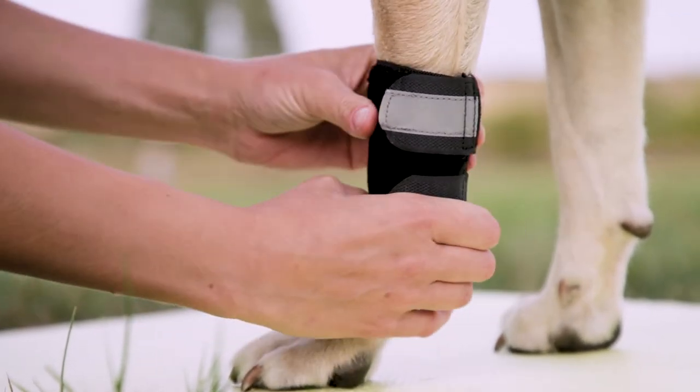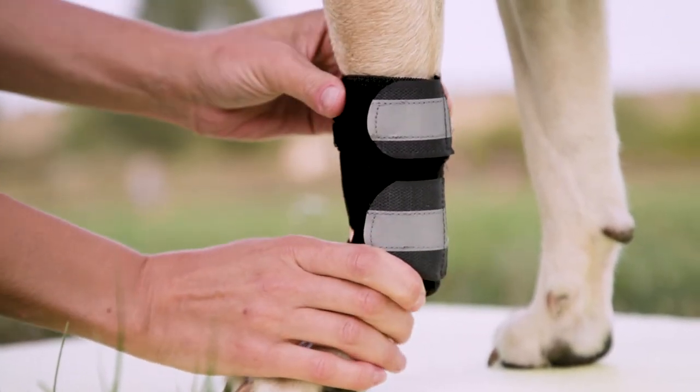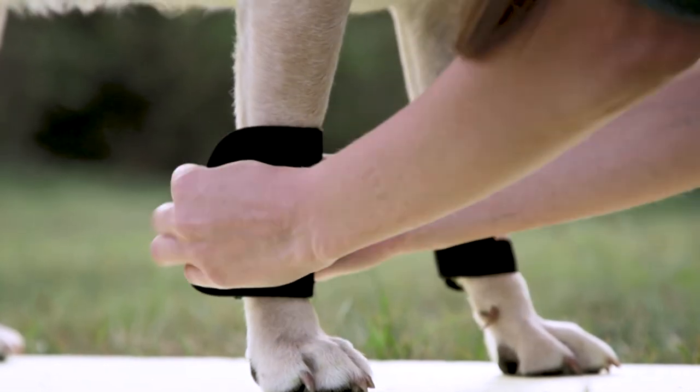Make sure the reflective straps are on the outside of the leg. Adjust the brace as needed, then do the same for the right leg.